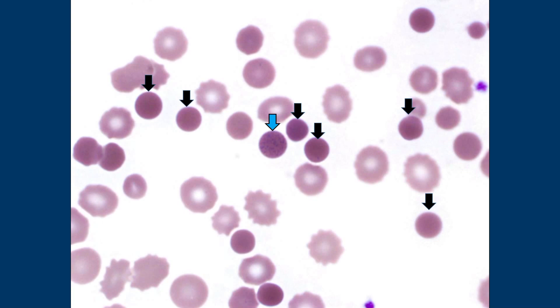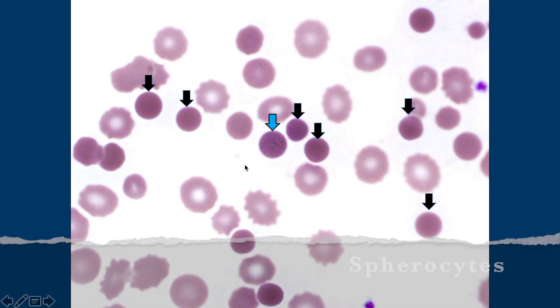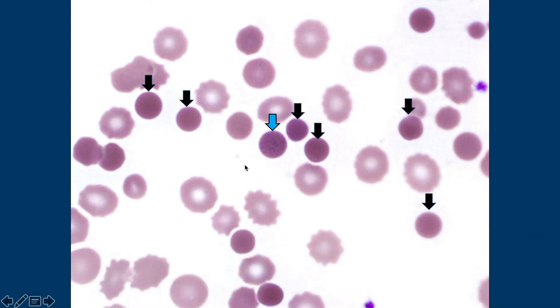Those cells are spherocytes — because they're a sphere. And the blue one, if you look really closely, you can see some fine basophilic stippling — it has little dots, which is why it got its own special color. This patient doesn't have a history of hereditary spherocytosis, and if she did, I would expect pretty much all of them to look like spherocytes.